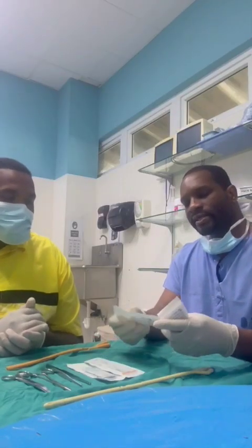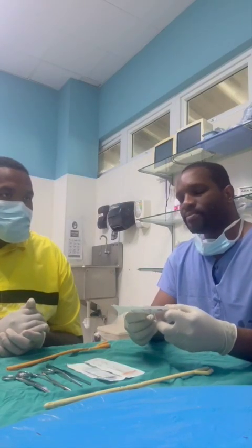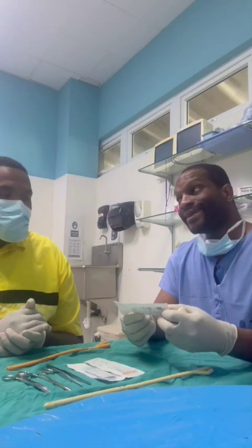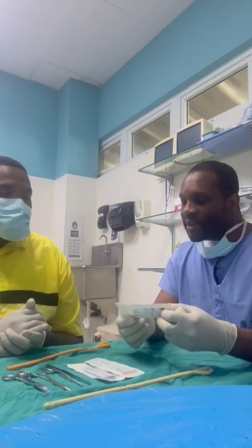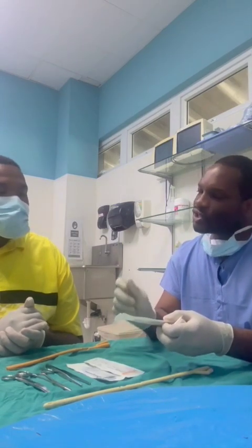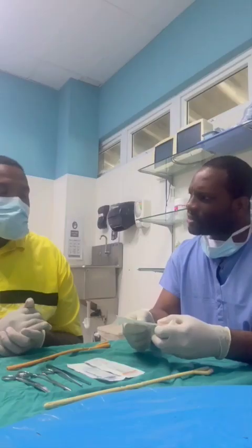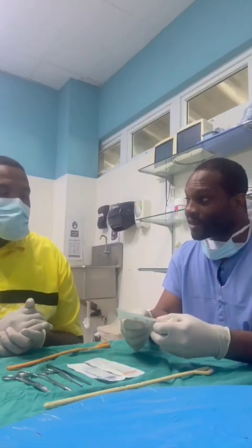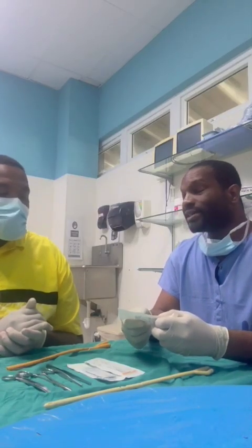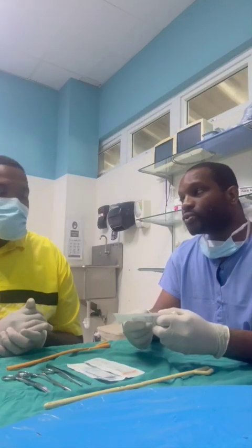This is the Prolene suture, or polypropylene. It is a synthetic suture, and it is a monofilamentous suture. Polypropylene is used very often to close wounds because it gives good tensile strength. However, it has a good memory, meaning it has a tendency to assume the packaging configuration of being curled up. So when the surgeon is using it, it tends to curl up. For that reason, it is difficult to handle, but it passes through tissue easily. It has good memory and therefore poor knot security. So we usually make 5 to 8 throws for a secure knot.